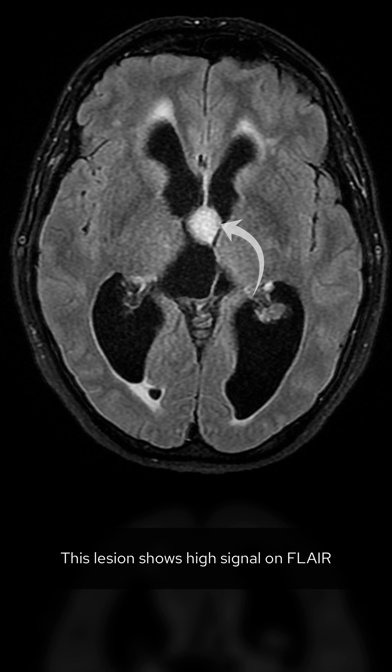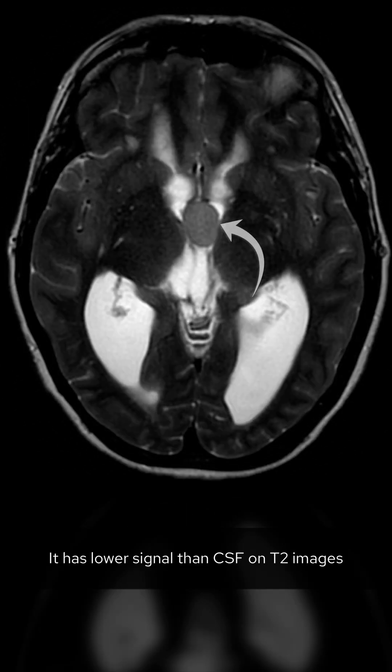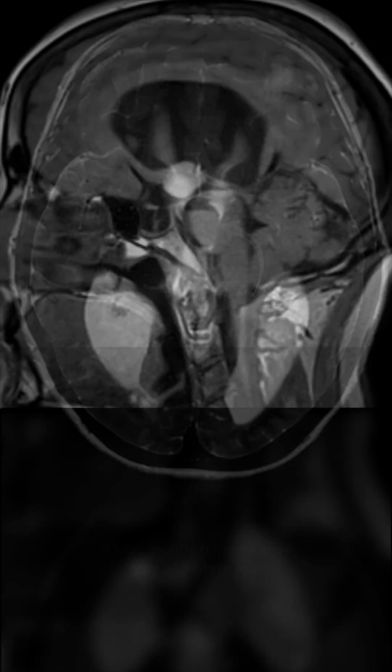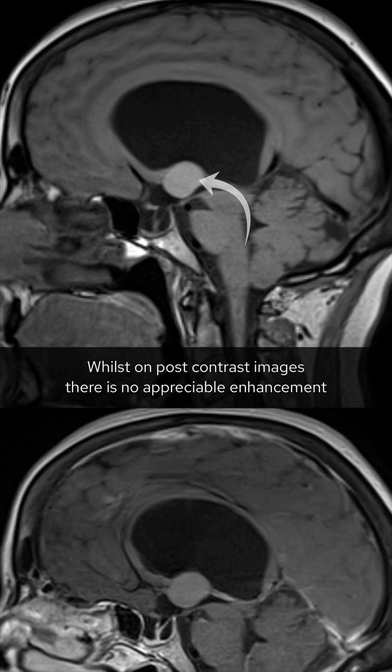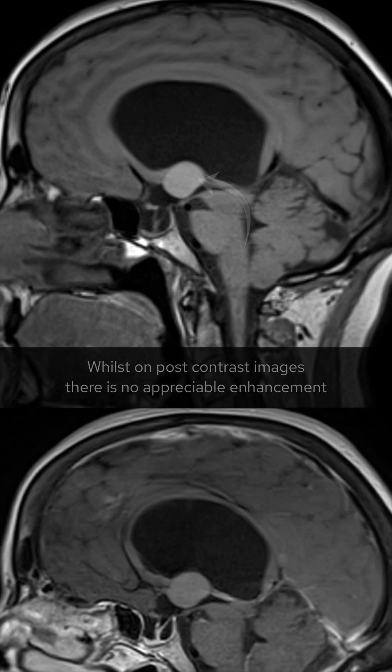This lesion shows high signal on FLAIR. It has lower signal than CSF on T2 images, whilst slightly hyperintense to grey and white matter. It shows higher signal than the adjacent brain on T1 images, whilst on post-contrast images there is no appreciable enhancement.